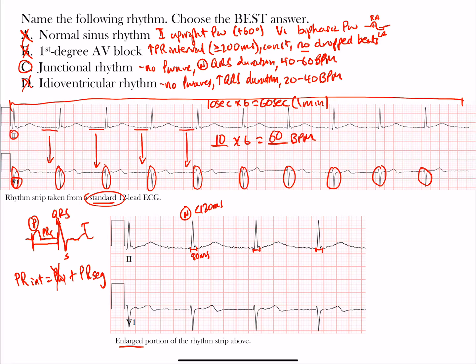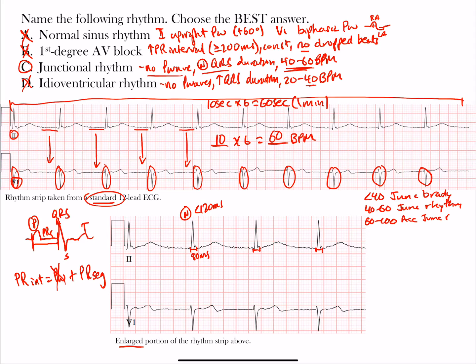The rate of approximately 60 beats per minute is clearly above the 20-40 range of idioventricular rhythm. With normal QRS duration, no P waves, and a rate around 60, this is a junctional rhythm. For context on junctional rhythm subtypes: less than 40 beats per minute is junctional bradycardia, 40-60 is junctional rhythm, 60-100 is accelerated junctional rhythm, and over 100 beats per minute is junctional tachycardia.